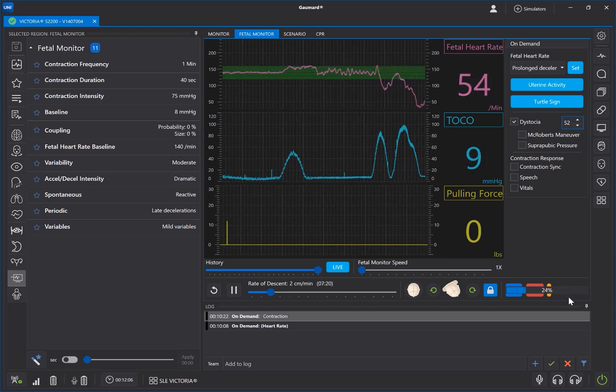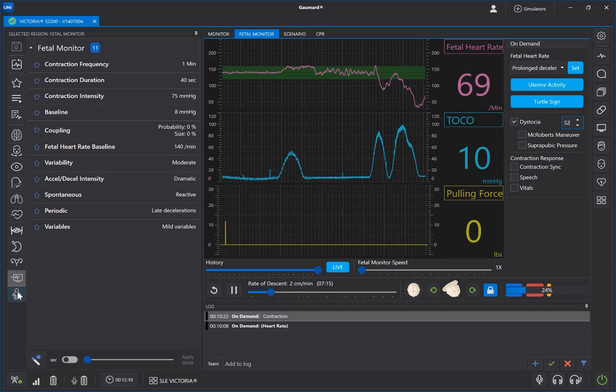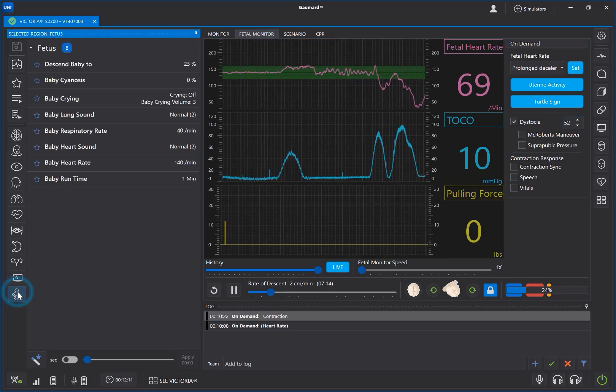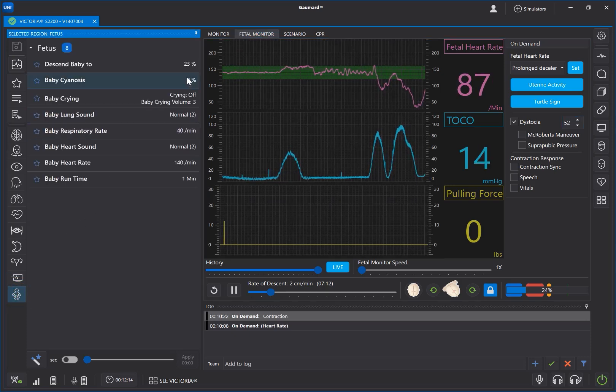Remember to set the vitals for the postpartum newborn before the labor ends. You can find these vitals in the Fetus subsection of the Vitals menu.